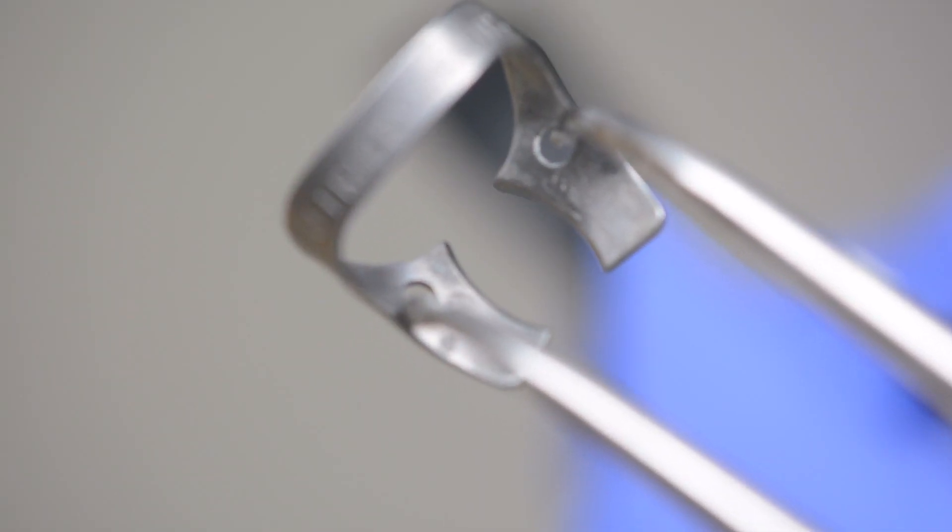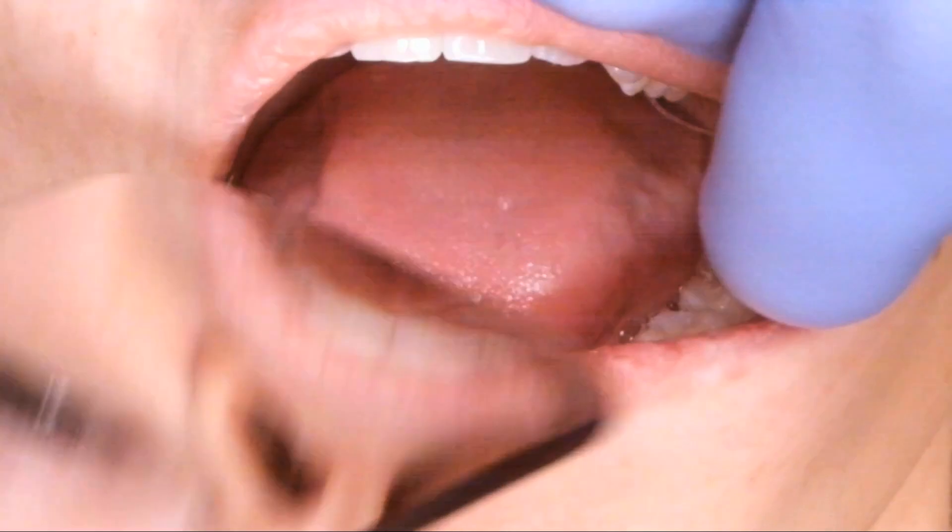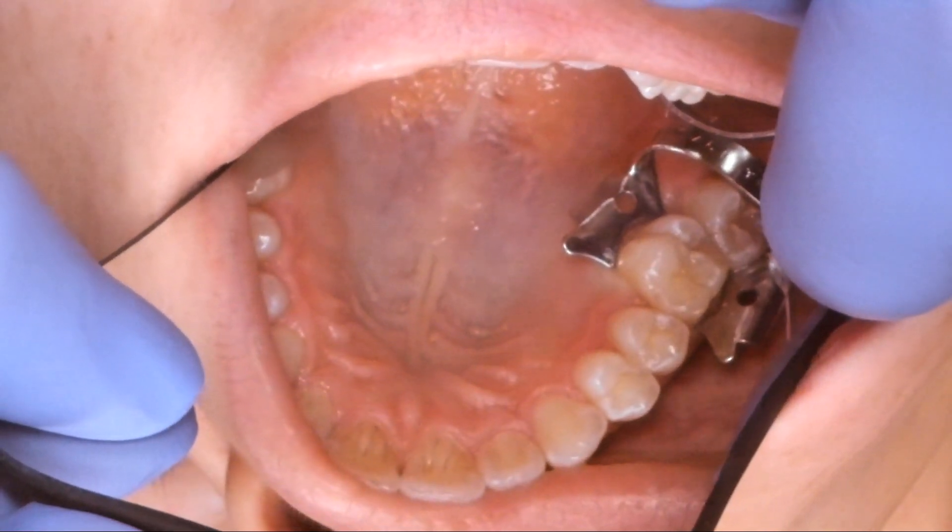What is up guys, it's Dr. Sammy and today I want to review how I place the rubber dam. The rubber dam is an awesome tool used in dentistry to protect the back of the throat and maintain isolation for procedures that require bonding.